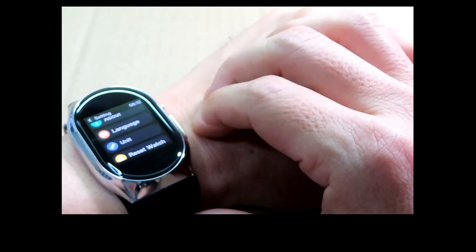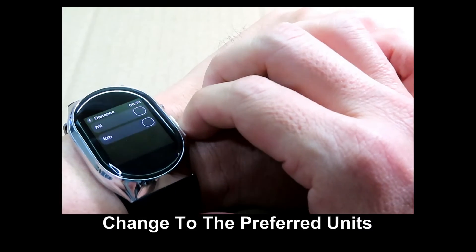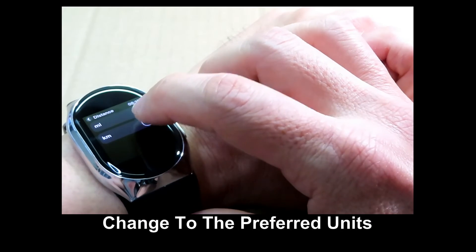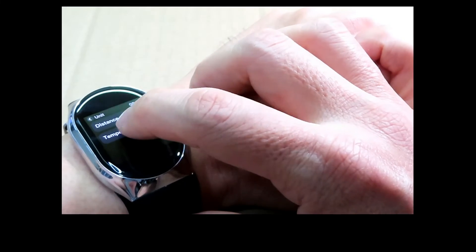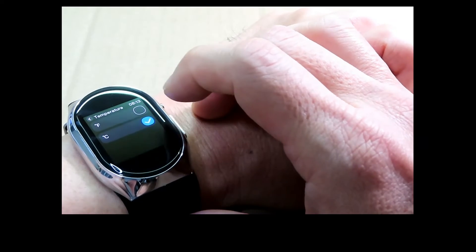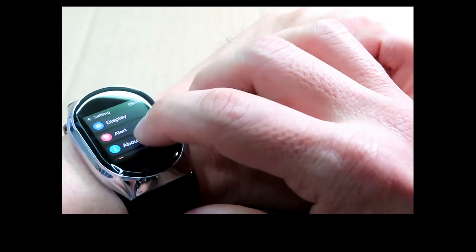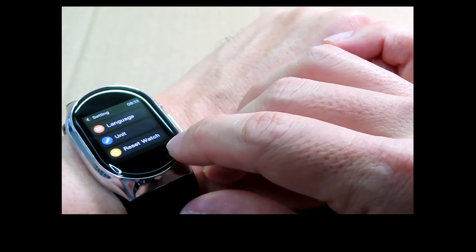Under settings you can change your language, and under unit for distance you can set it as kilometers or miles — we'll set it as kilometers. For temperature, we'll set it as degrees Celsius. There is also a reset watch option if needed.